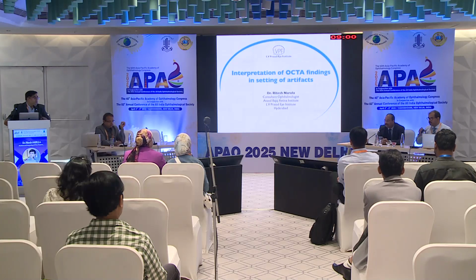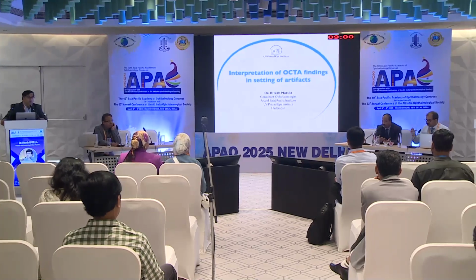Absolutely. It can actually empower us to even pick up preclinical diabetic retinopathy changes, and I'll be referring to that.